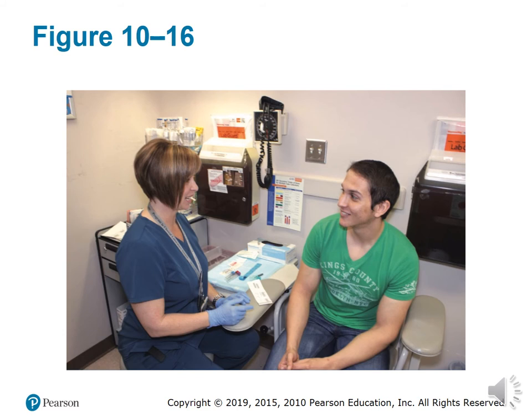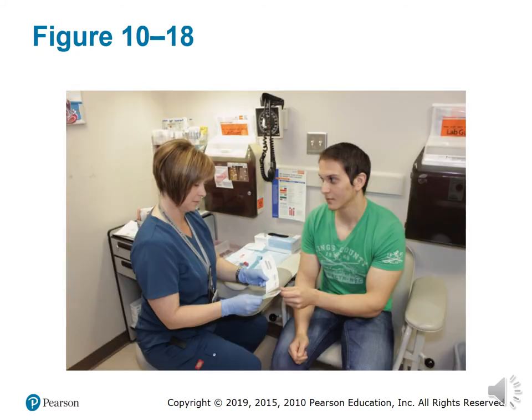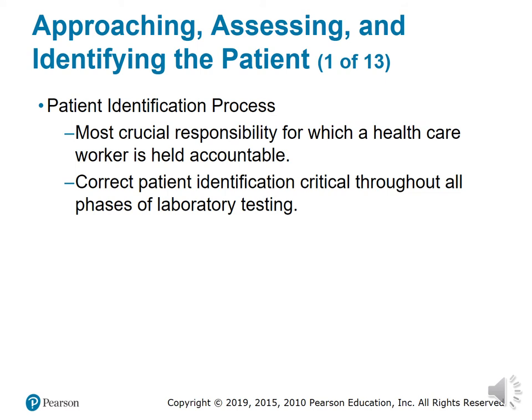See, here she's interacting with the patient, going over her questions. Like he's showing her ID, so she's verifying that his information is correct with what she has on her requisition there in her left hand. And she's still verifying, and she's getting ready to hand it back to him. Right. Approaching, assessing, identifying the patient.